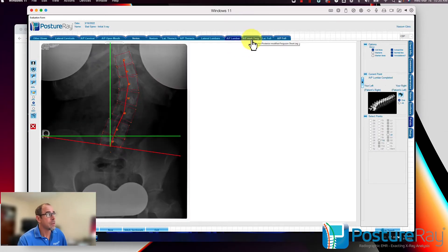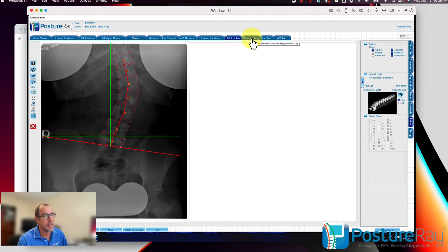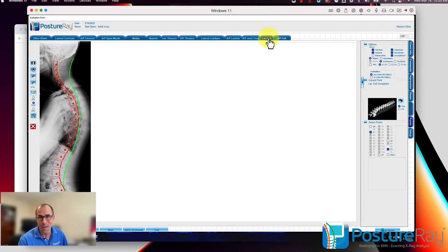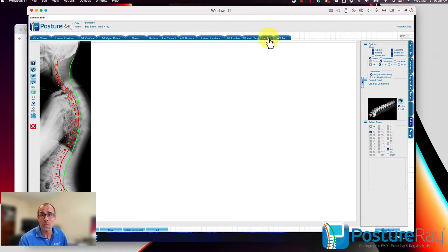We also do short leg analysis. We can even stitch the lateral cervicals, lateral thoracics, and lateral lumbars — or combinations thereof — into a lateral full spine or AP full spine X-rays. So if you get images sent to you from an outside facility like a radiology facility, you can stitch those into a full spine.